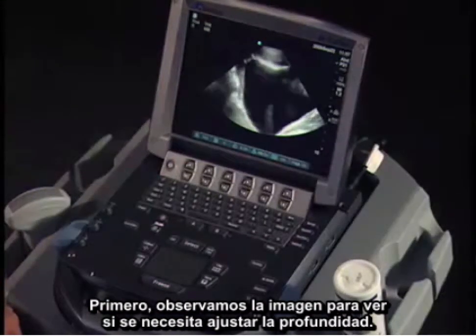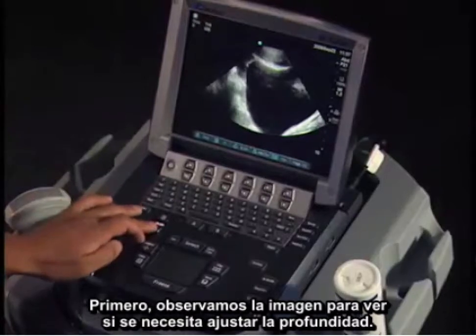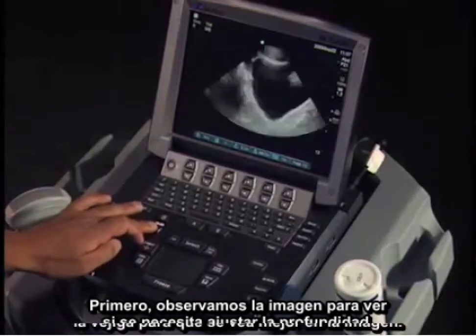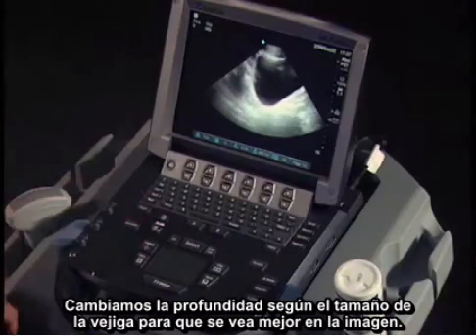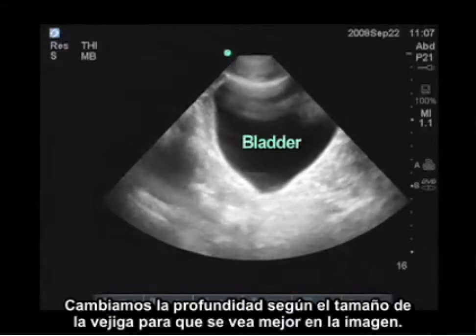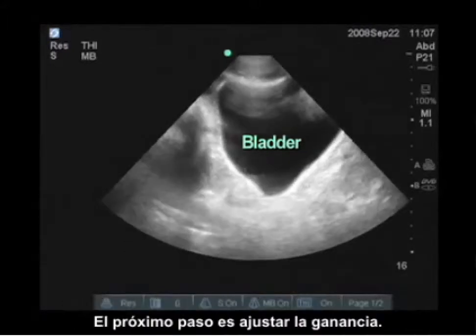First thing I'll take a look at when I see the image is that we need to adjust our depth. I'm changing the depth here to make this bladder a better size so it fits better within the image.